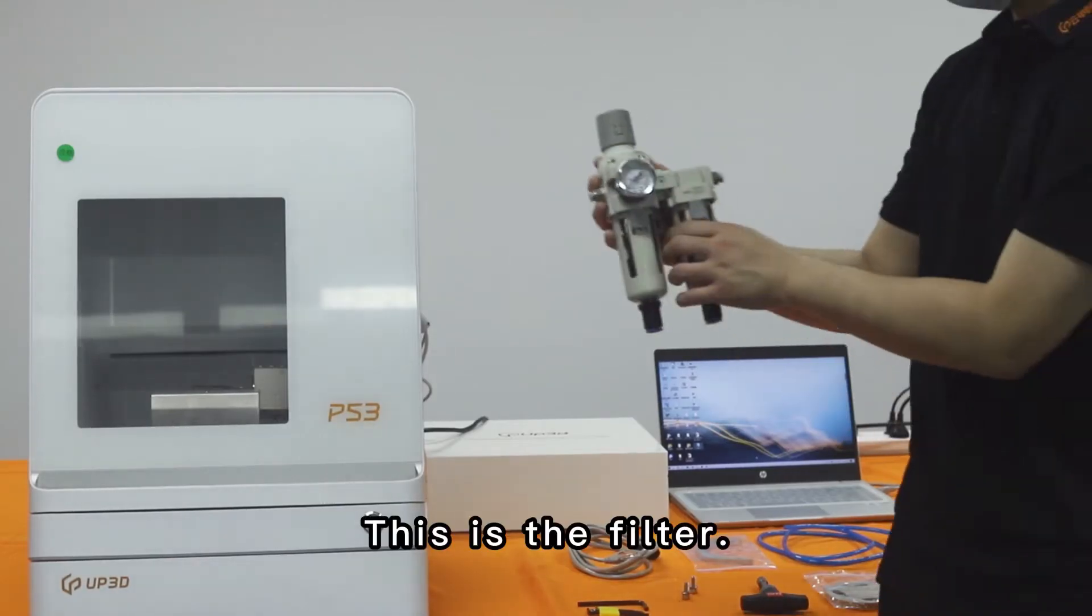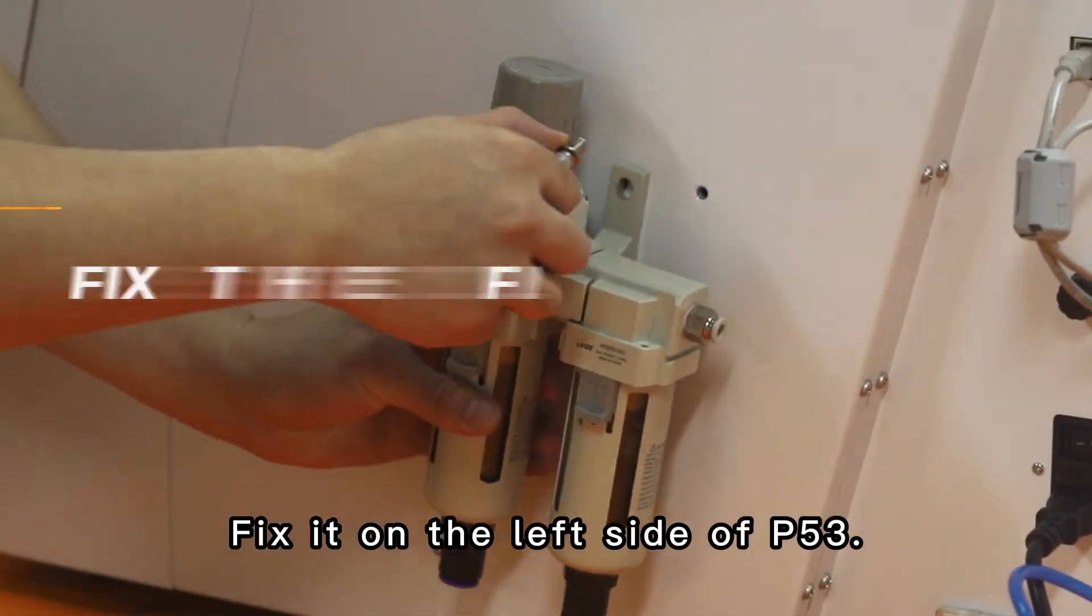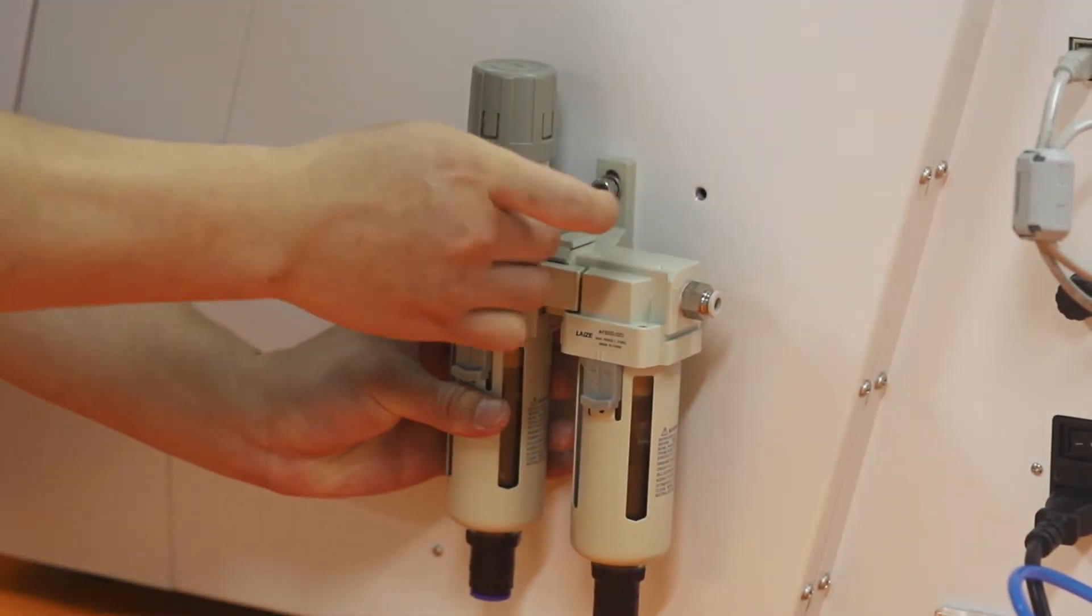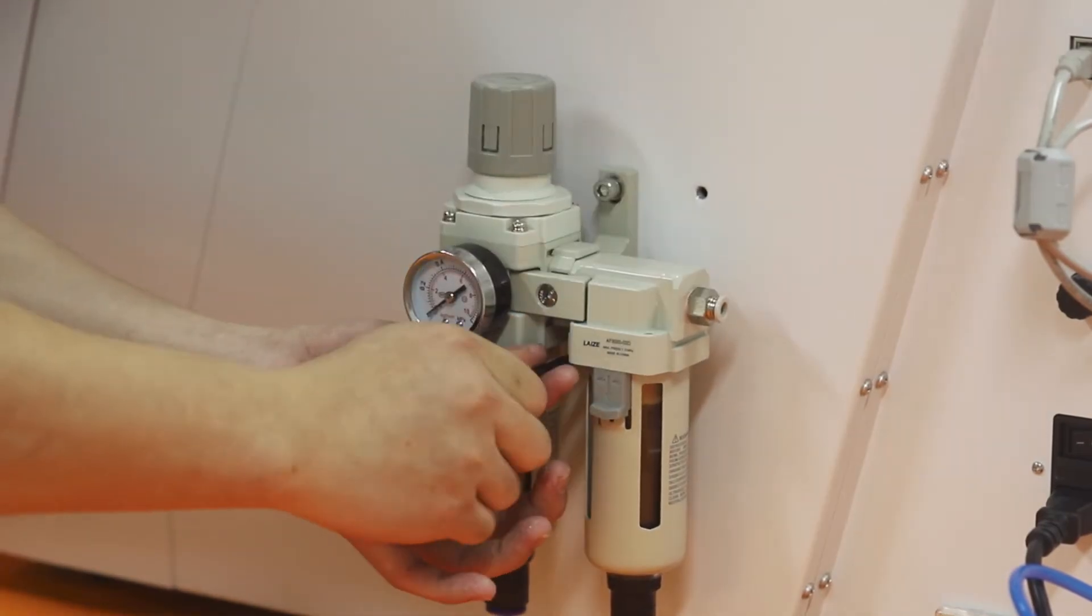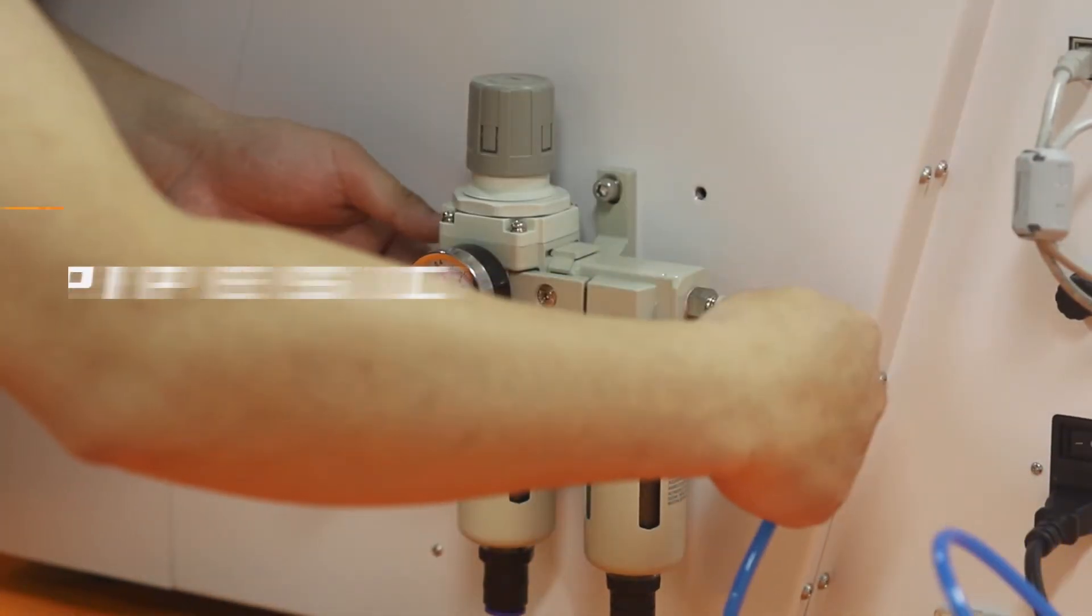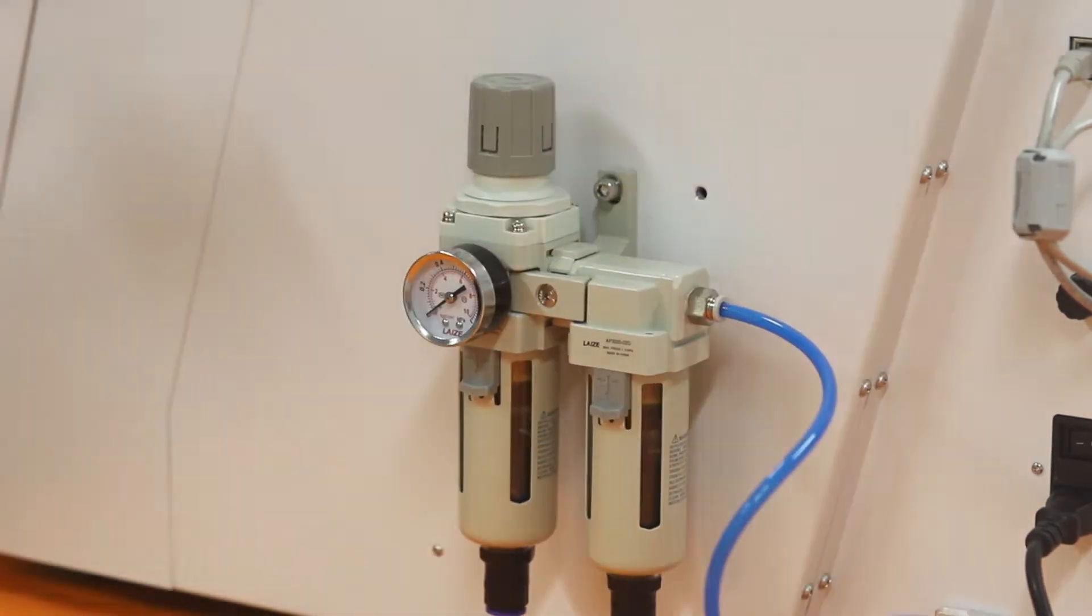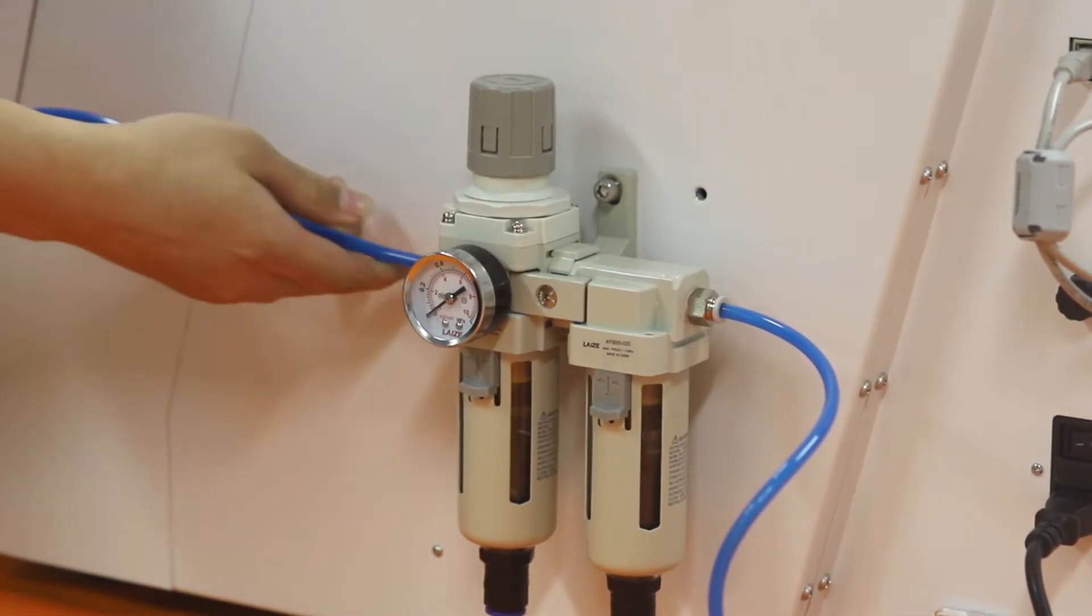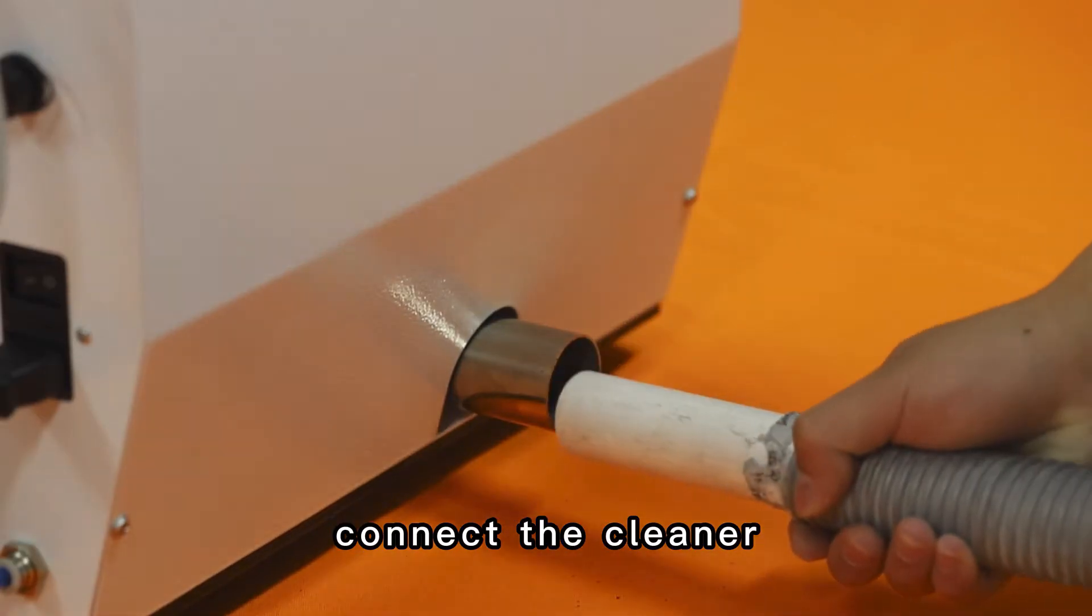This is the filter. Fix it on the left side of P53. Connect the pipes. Connect the cleaner.